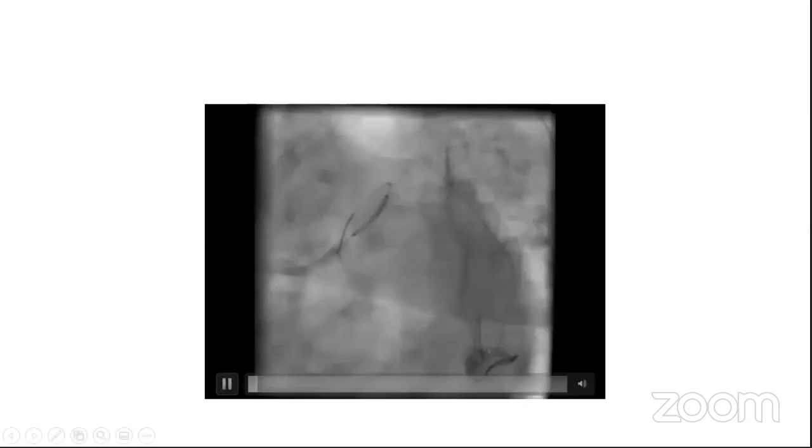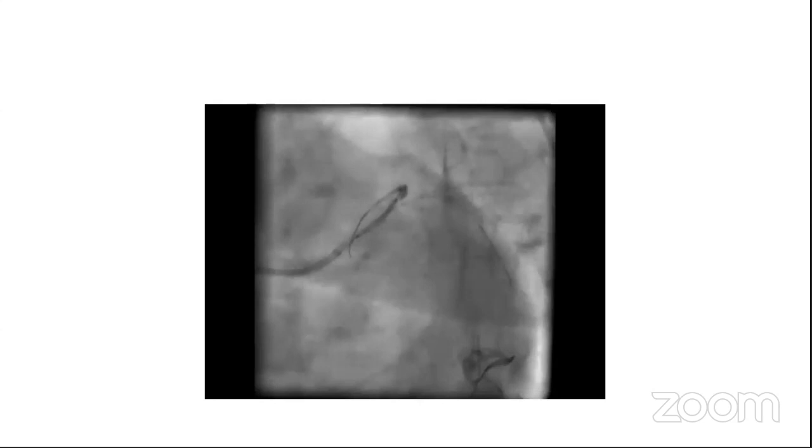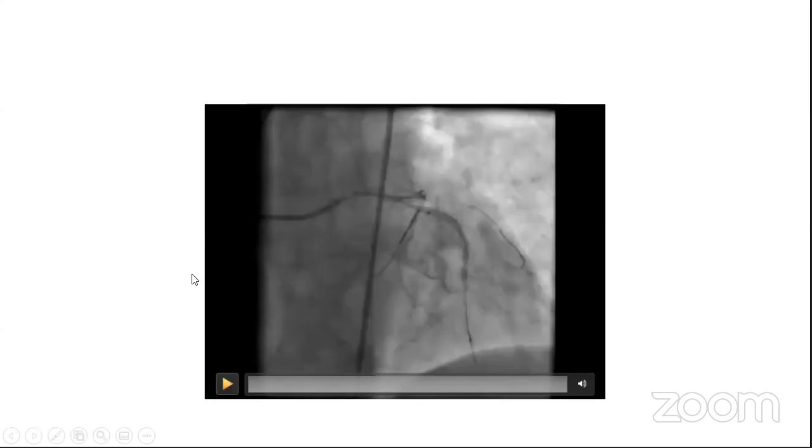I'm focusing here on the stent so I can adjust its position, as you can see here. I do not need to stent down to the ostium. This is a very long left main, and it has a very healthy shaft, so I do not need to stent down to the ostium. I will just show you that this stent covers most of the left main shaft, at least the straight part, and it covers the LAD down to beyond the subtotal occlusion.